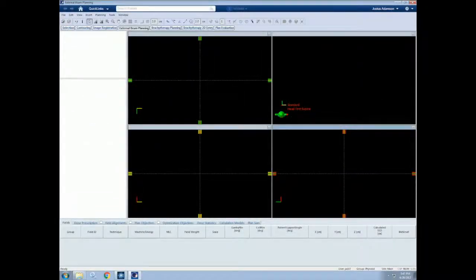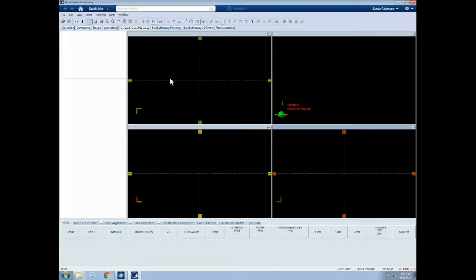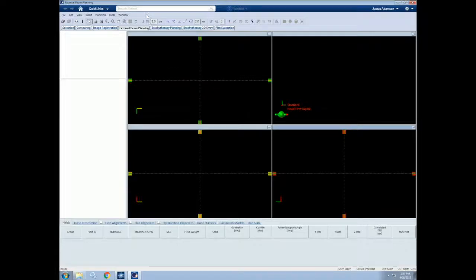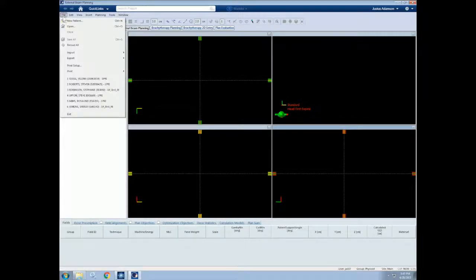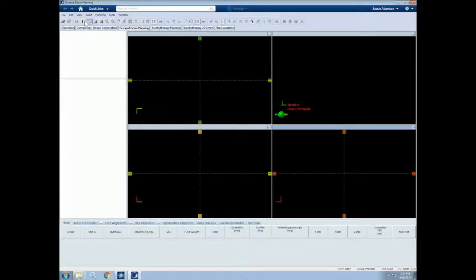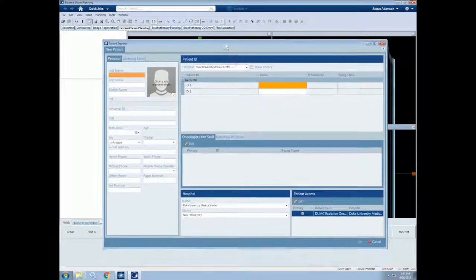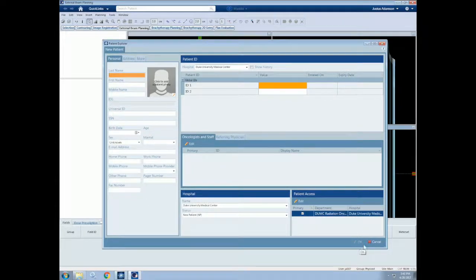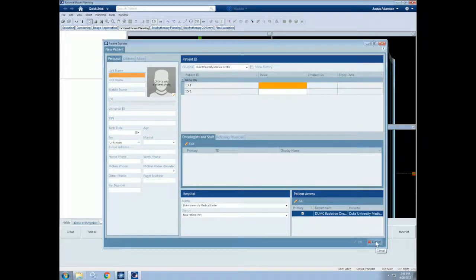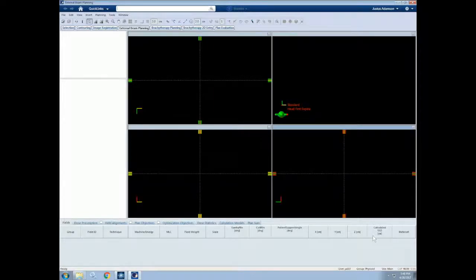Let's begin by discussing how to open a patient from the external beam planning main menu. There are a few different ways to open a patient. If the patient already exists, we can simply search for the patient as I discussed in the first tutorial with this text box at the top. If we would like to create a new patient, however, we can go into the File menu and select New Patient. We then get this window that allows us to enter all of the patient's information and then select OK. Another option for opening a patient is to import images into a new patient that we would like to create.